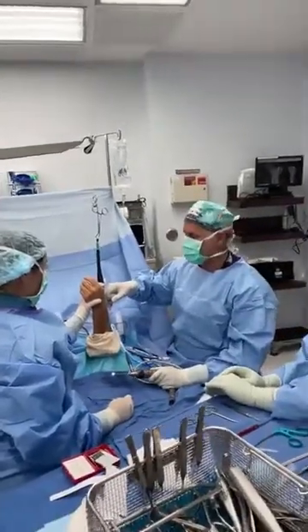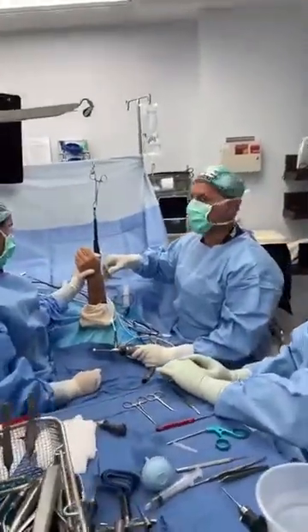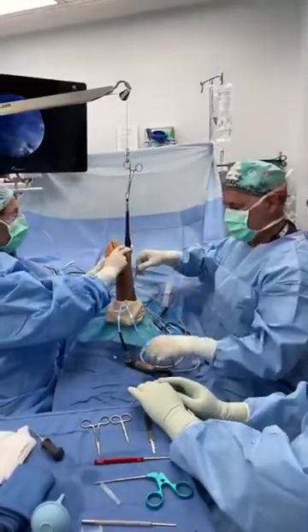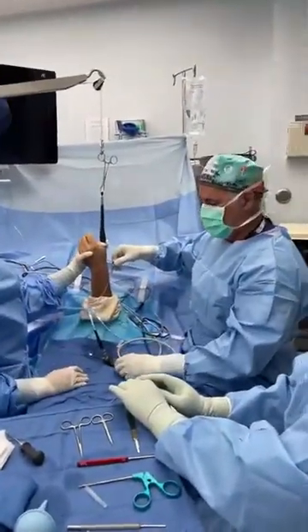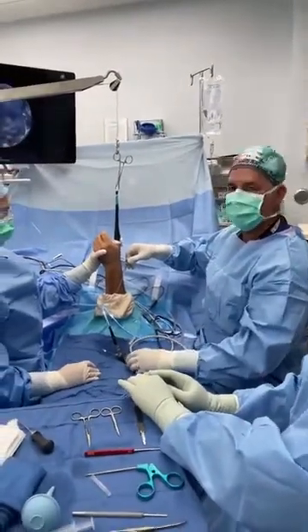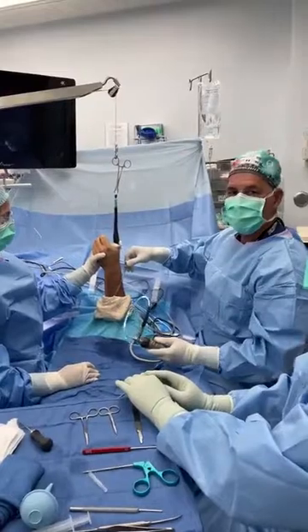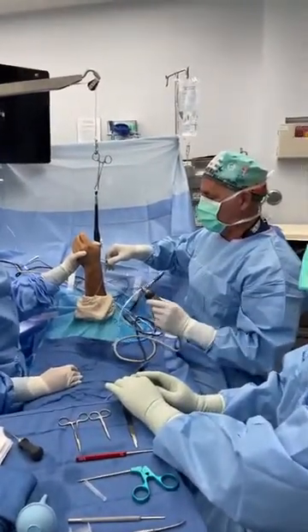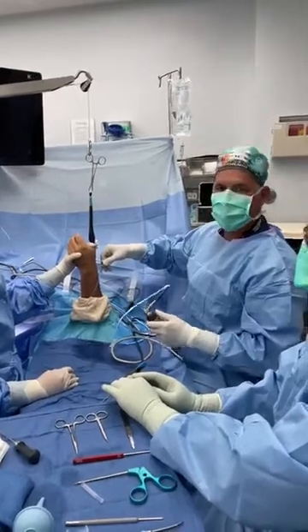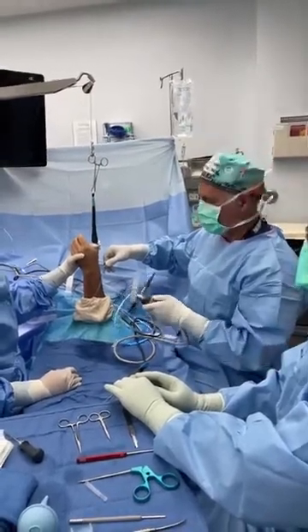Dr. Bonilla here with Hashtag Live Surgery Tuesday. Today we have a manual worker — you can see a big heavy hand. He had a work injury some months ago and has had persistent pain at the base of the thumb. X-rays are relatively normal, but in my experience these folks have a ligament injury, and MRIs are really a waste of time and money, frankly.